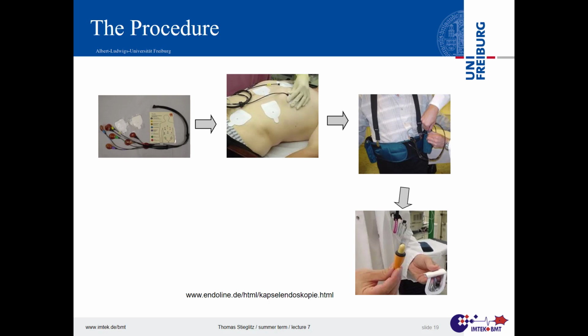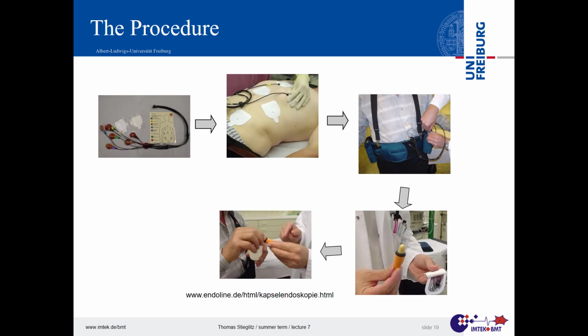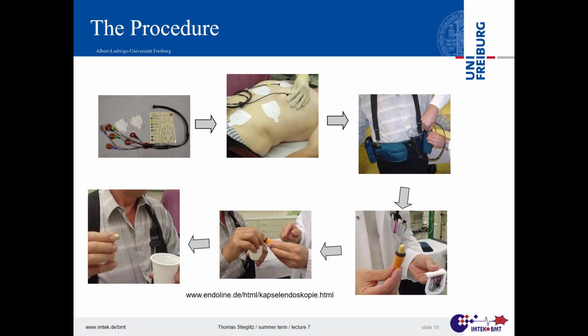And therefore, there's that blister pack where the sterilized capsule comes with a quite convenient holder and a kind of rubber ring to keep it in, and then you can take your teeth or your lips and put it out there and swallow it without the germs and touching of a third person. I think that's quite smart. And even if the doctor holds it, the other person can take it without foreign germs, just your own. And then take a cup of water and try to swallow it.